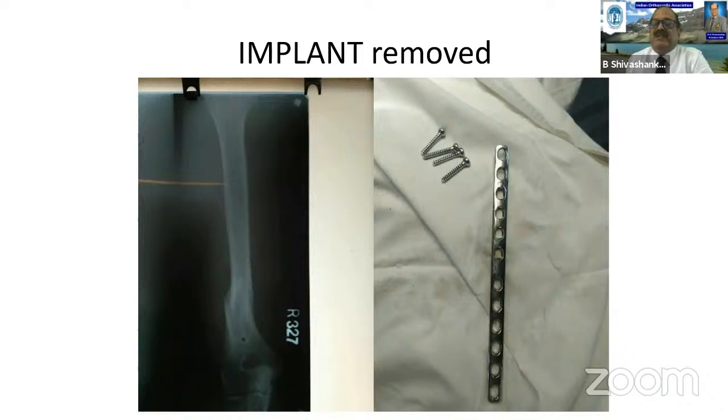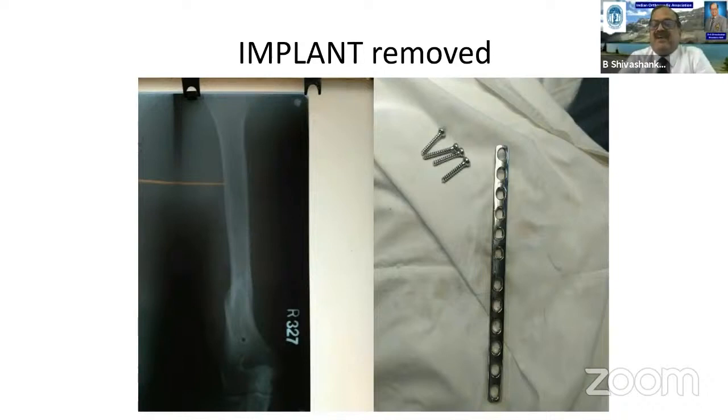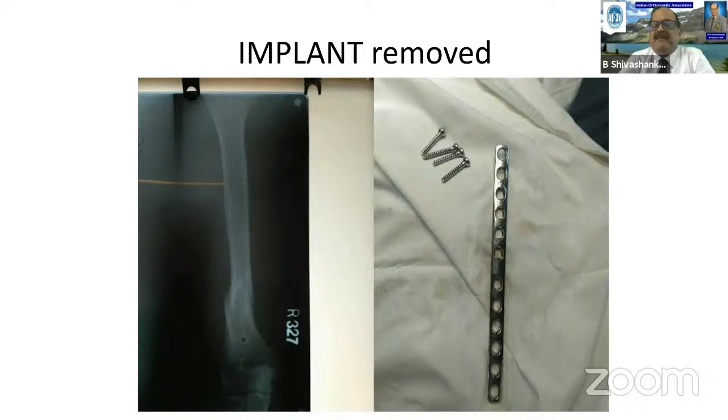Any thought about the removal of the implant, both Sergio and Belangero? Why do you remove this implant, Shiva? Two reasons. It's not a prosthesis that has to live within the body. It's always better that the bone takes the original load, and with the implant, sometimes there is disuse atrophy within the bone. In the long run, there will be some periplate fractures. I've seen quite a few of them which were not removed. So that's another reason.